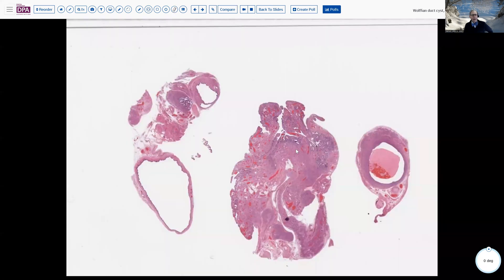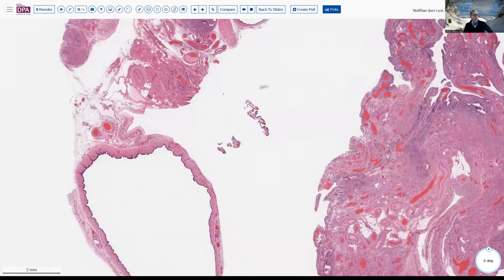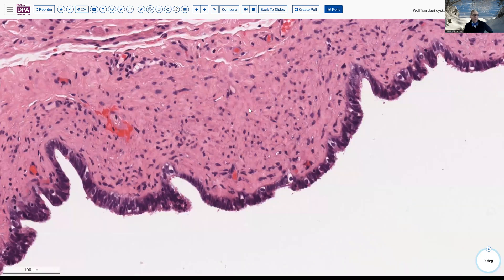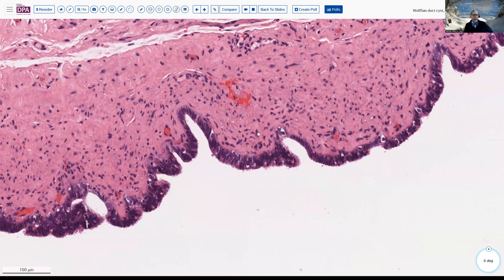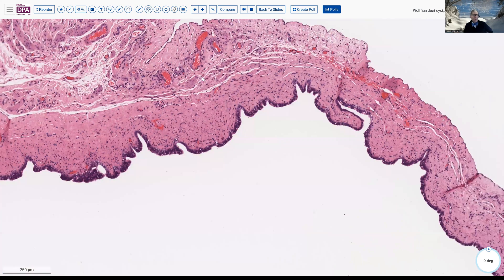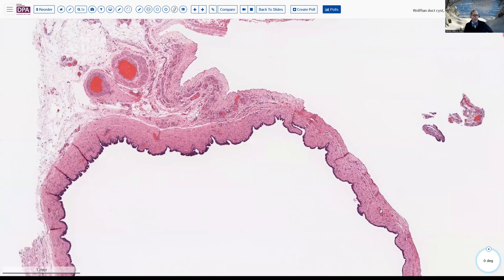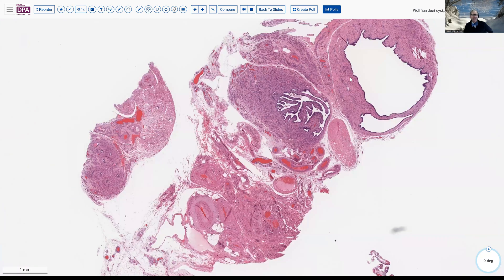Here's one in the broad ligament or adjacent to the tube. We see normal tube, and then this cystic structure. Compared to our previous thin-walled paratubal cysts, this does have a little thickness to the wall. As we look at the wall, there is a degree of smooth muscle in this tissue — not just bland fibrous tissue. Additionally, as these become cystic they tend to have an undulating surface and a little bit of tufting, somewhat akin to the fallopian tube, and so they are sometimes mistaken for a hydrosalpinx. But the surface tends to be more undulating and ragged, and there is clearly lots of smooth muscle in the wall.